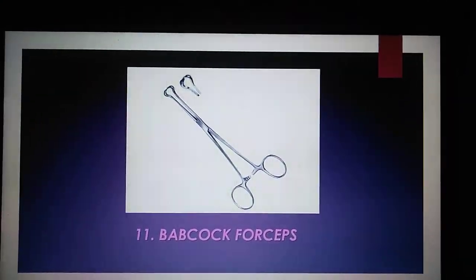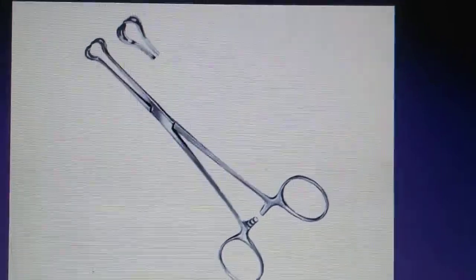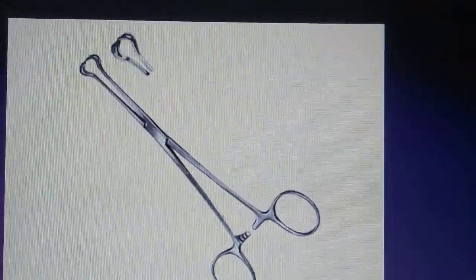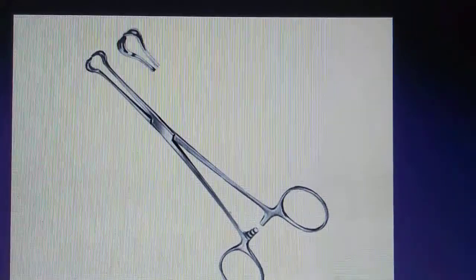The Babcock Forceps are used to hold a shorter section of the intestine with minimal trauma or constriction. These forceps are polished to a dull satin finish to minimize glare below operating room lights.